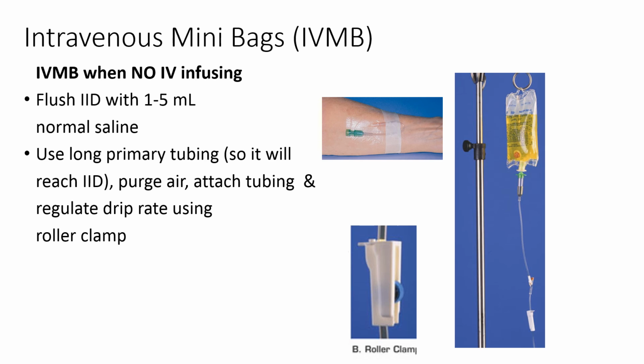I will tell you that sometimes in the clinical setting with IV mini bags, we will see them attached to just normal saline. Again, the IV mini bag will be run as a piggyback. The rationale for this is that we want to make sure that they receive all of the IV mini bag. A lot of times, if we use just primary tubing, there is a lot of medication that's still left in that tubing. Whereas if we run it as a piggyback, we can run the whole antibiotic through with a flush. Again, we will explain this fully when you are on campus in the laboratory, but please ask if you don't have an understanding of this.